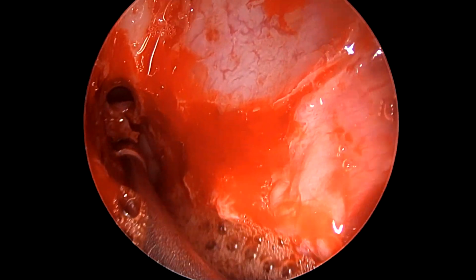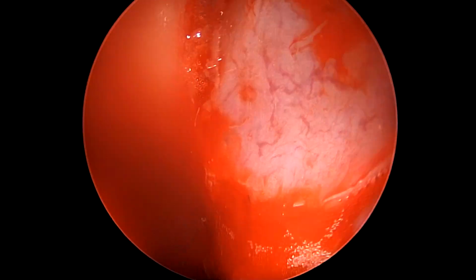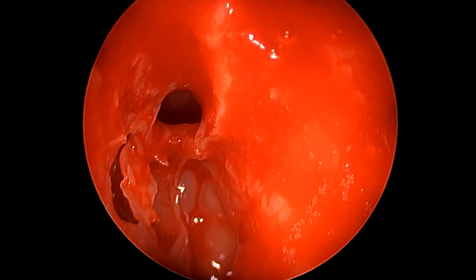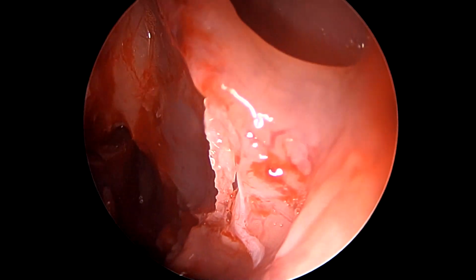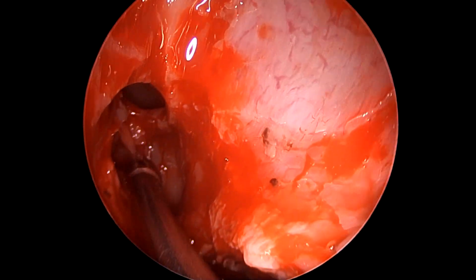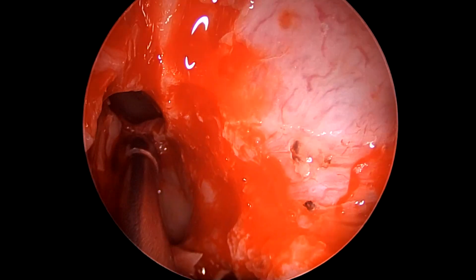Each time there's something, we can obviously wash it. And now you see that the actual frontal sinus above this cell is now being opened. The amount of bone that required to be punched was quite a lot. Now that we have opened, the most anterior part of it is actually the frontal sinus. So we need to still open it slightly more to get a comfortable entry inside the frontal sinus. Difficult anatomy is sometimes a problem. And now we see how, more anterior as compared to this cell, we have actually gained access to the frontal sinus proper.